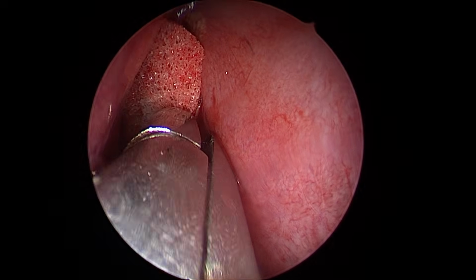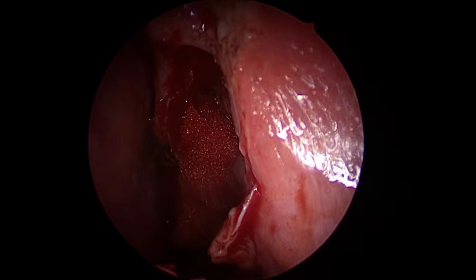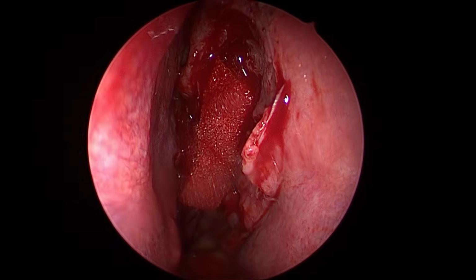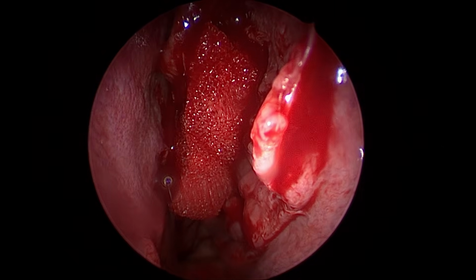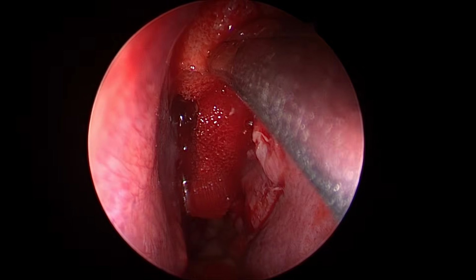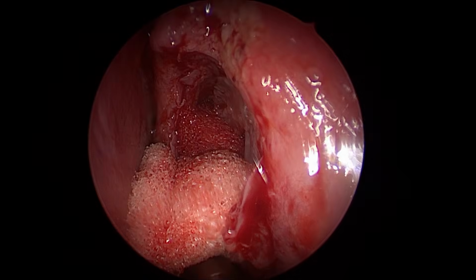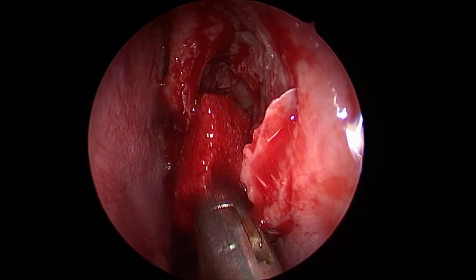Use them in between to improve your visualization. See this? Visualization is the key. The single most important determinant of complication is too much bleeding. It doesn't allow you to identify the landmarks and then you keep operating. Single most important factor. So give adequate time.